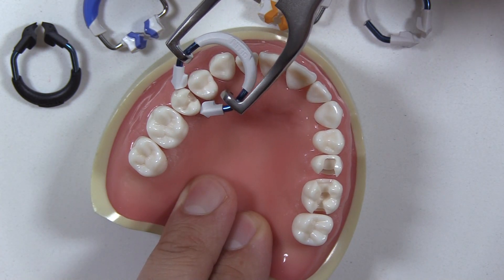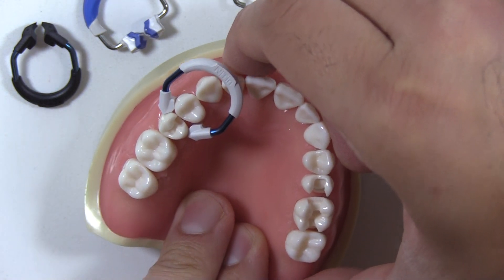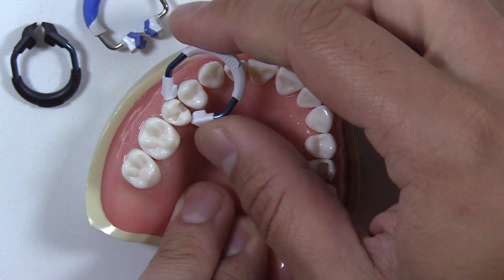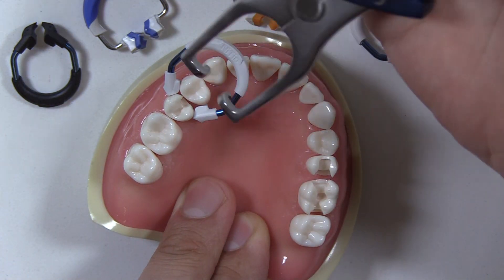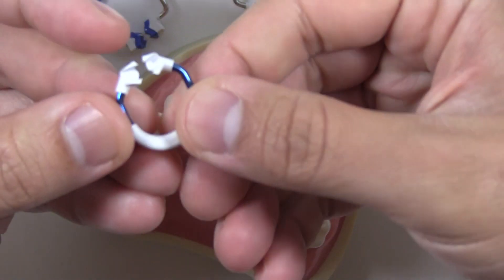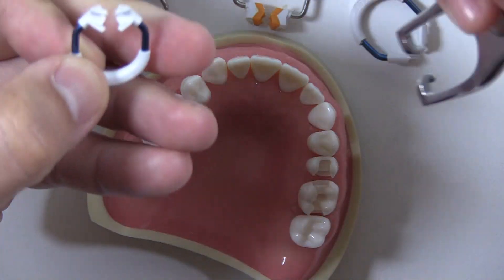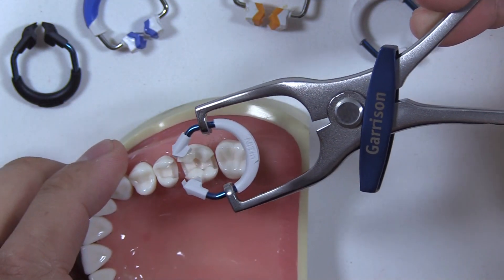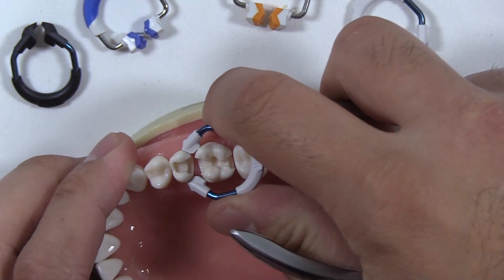What I'll do sometimes is place a ring and just see how it sits on the tooth. Where is it contacting the tooth? Does it actually stay on? Is it stable? This one is fairly stable — it's not even moving at all, it's really locked in place. The reason for that is because this specific set of rings, these reInvent rings, have little feet that really lock into the undercuts of teeth. That makes them really helpful for areas of wide preps or if you don't have a lot of tooth structure to hold on to — they just kind of lock in place.